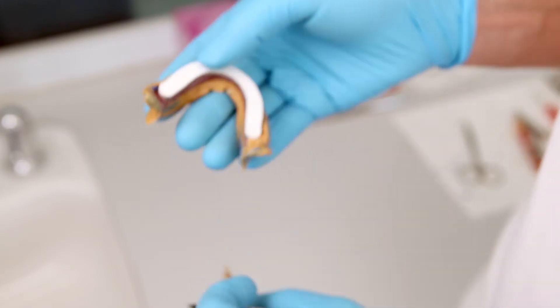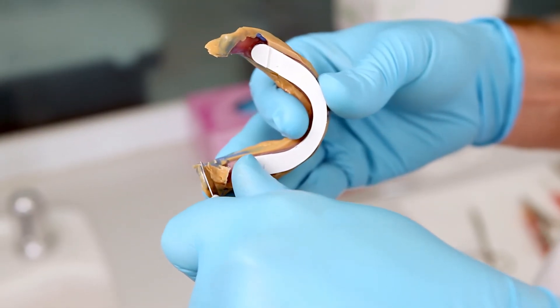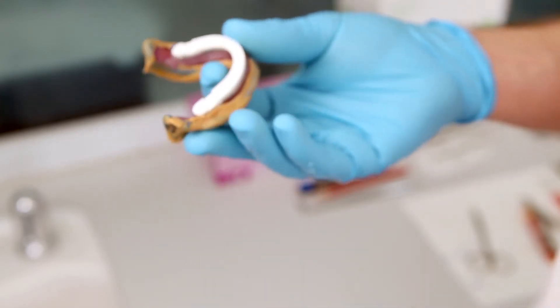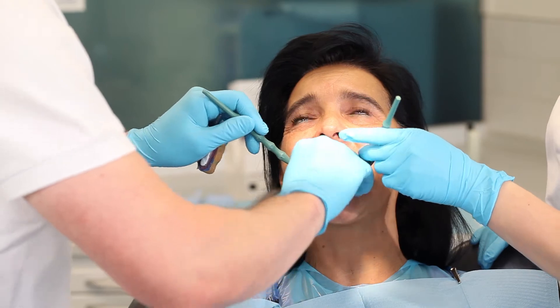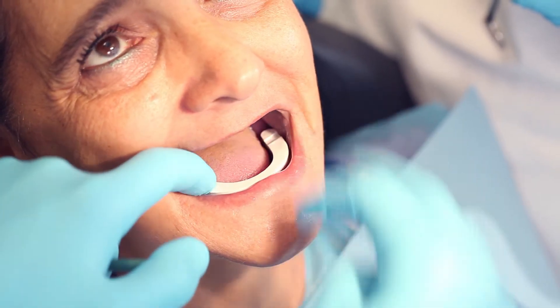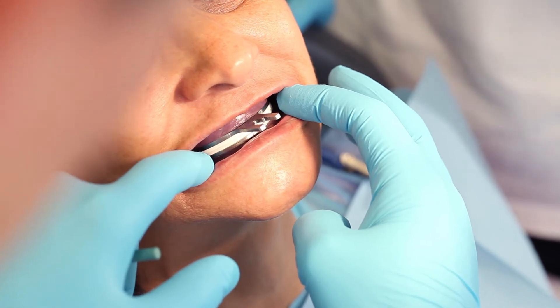Remove any excess in the area of the retromolar pads in particular. This will ensure smooth movements at a later stage. Check the stability and suction of the impression. When the jaws are closed, the bite plates should be positioned flat on top of each other.